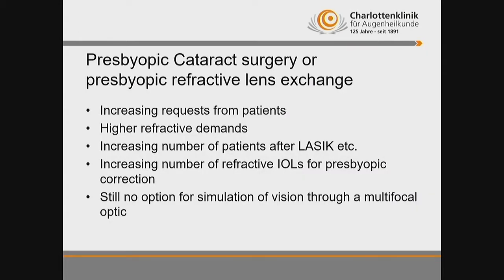If you're looking to the presbyopic cataract and presbyopic lens exchange patients, we have an increasing request of the patients and a higher refractive demand than it was 10 years ago. We have an increasing number of patients after LASIK or PRK, which also includes that there are higher demands for the refractive errors after surgery. We have an increasing number of refractive IOLs for presbyopic correction on the market, but we have still no simulation of the vision through a multifocal optic.